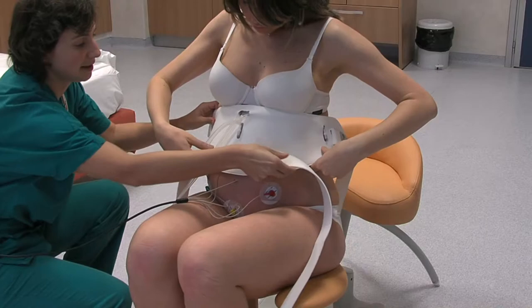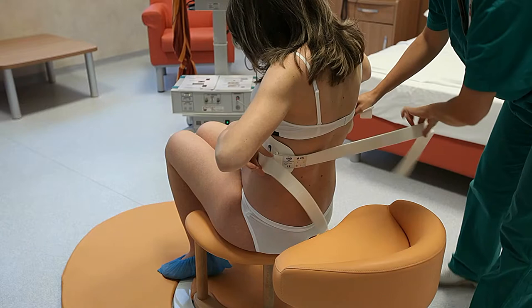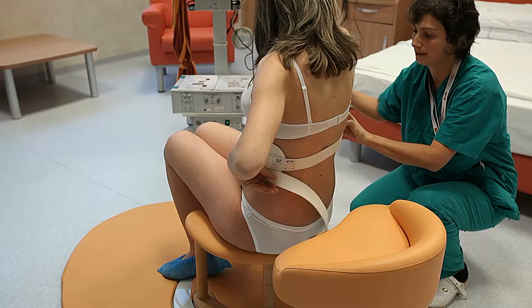Dopo aver applicato i sensori, l'ostetrica può agevolmente e semplicemente applicare la fascia con l'aiuto della partoriente. La fascia è fissata intorno alla vita, sul fondo uterino con comodi strap.